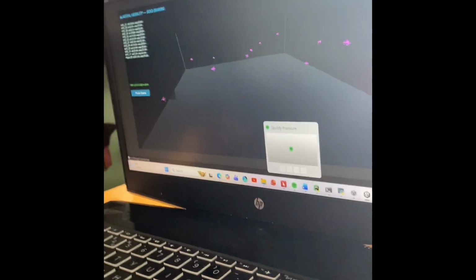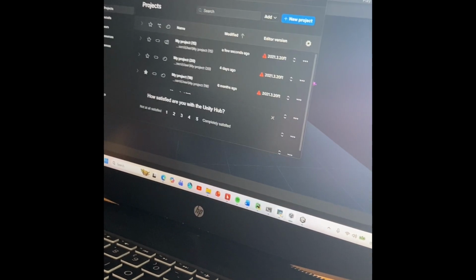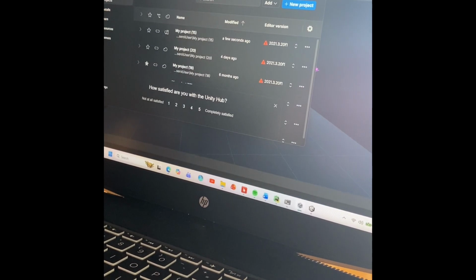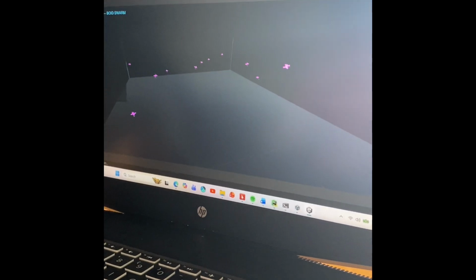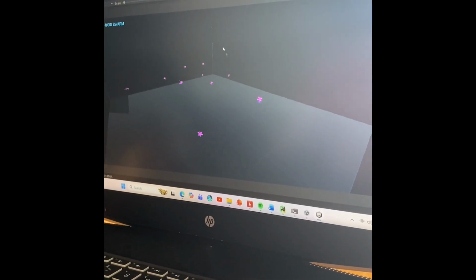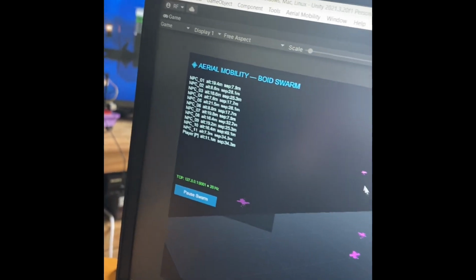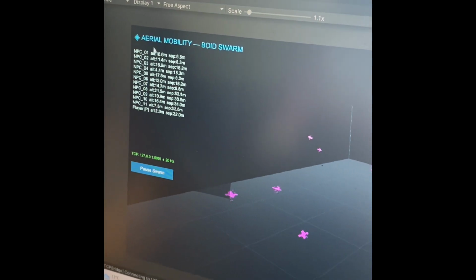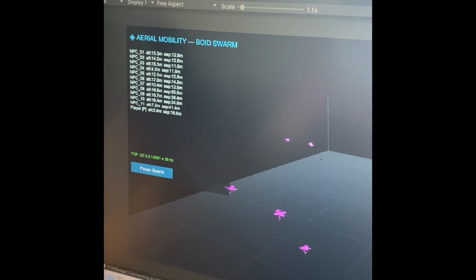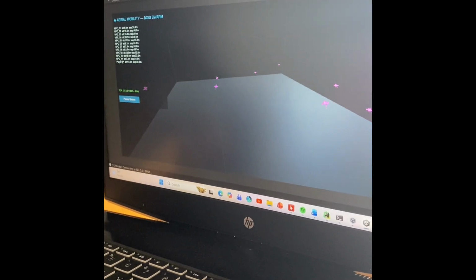So if any of these aerial vehicles get close to each other, this is the one that I'm controlling, you can see. If they get close to each other, they highlight in orange, and then they move away from each other automatically. So there you go, two of them moved within range of each other and they went orange and they move away from each other. As you can see, I'm controlling this one. So the idea is that this is a traffic management control system that allows for multiple users to exist within the same space at the same time safely.